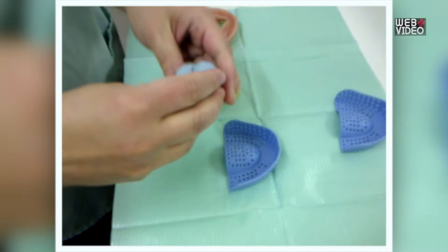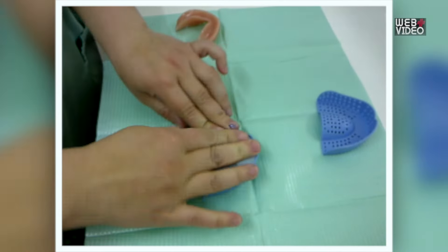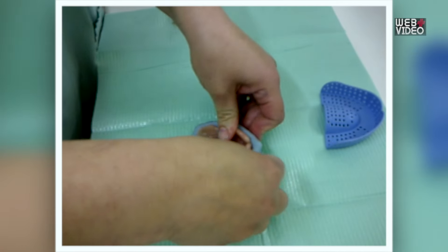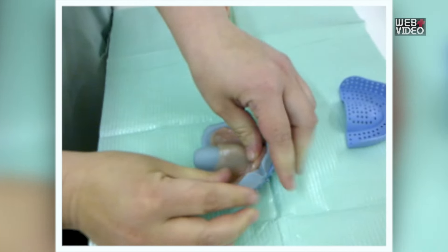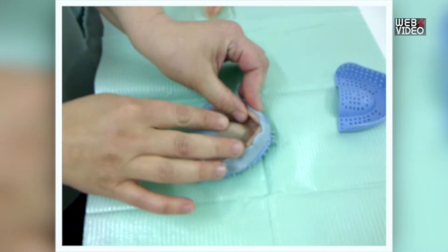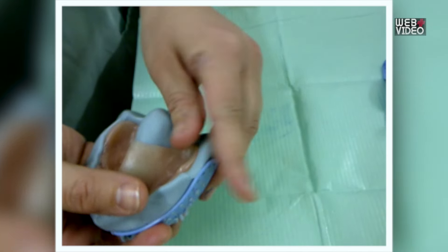Then place the mixture into the tray and press your dentures into this. You will need to ensure the putty covers all contours of the dentures but does not go inside the dentures themselves.